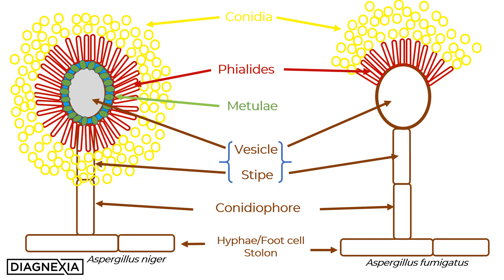The conidiophore is born by a hyphal form, or foot cell, or stolon. Similarly, Aspergillus fumigatus has a foot cell or stolon, conidiophores, a stipe, and a vesicle. But clearly you can see the absence of a metulae layer, and the phylides bear the conidia only on the superficial two-thirds of the surface of the vesicle.